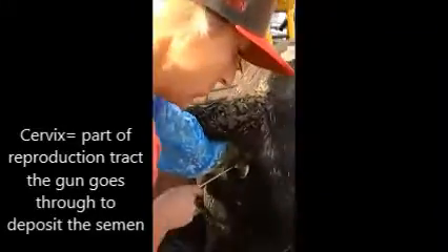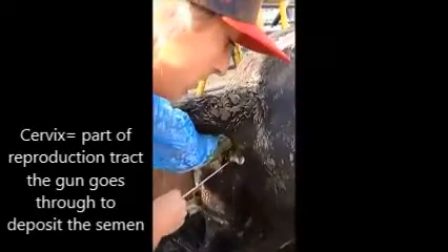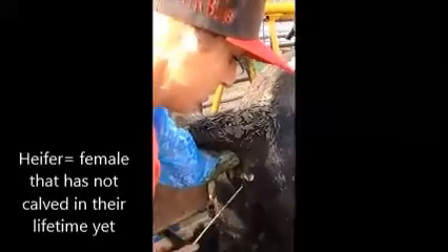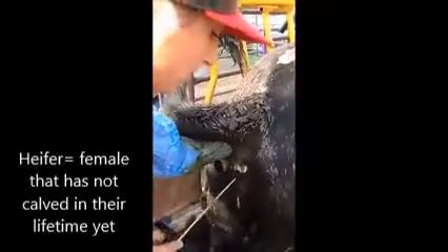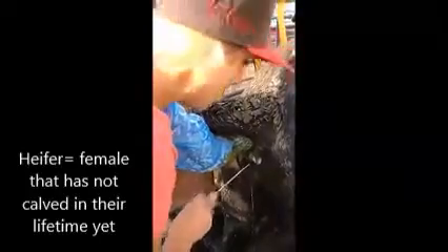What's hard about these heifers is their cervix is only about the size of a pencil. So I'm trying to get this gun into something that's about the size of a pencil. And you're trying to feel through a ligament and through manure. And it's expensive semen so you don't want to mess up.